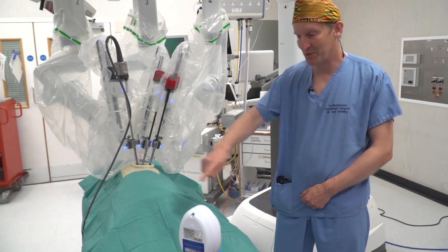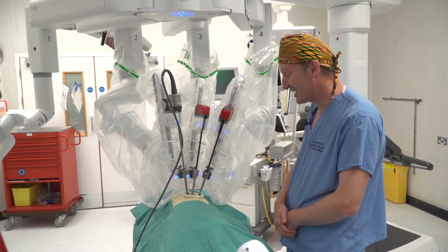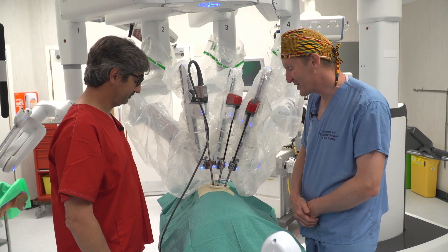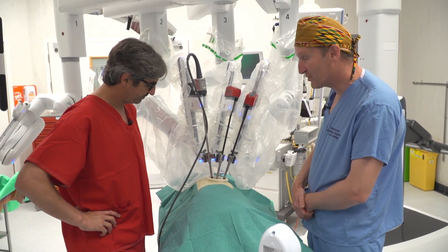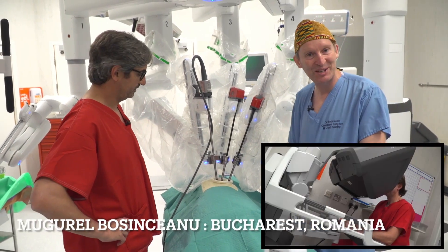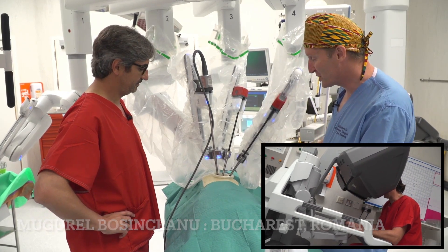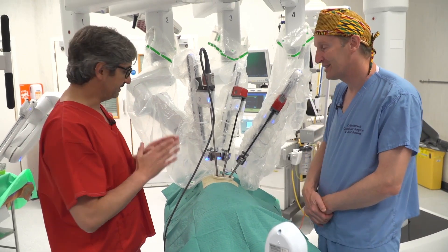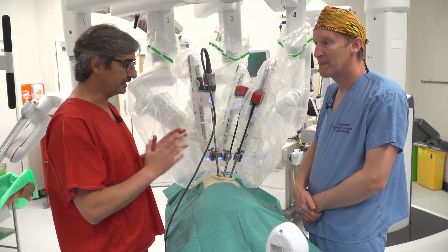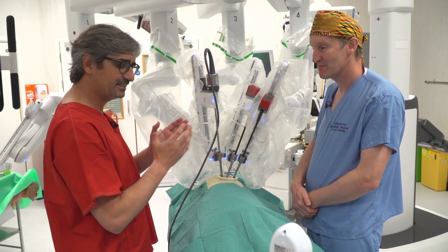Let's go to the robot. Here we have a patient — slightly plastic — who has agreed to have a right upper lobectomy. We're also very lucky to have Mugur on the console from Romania. Talk us through the key points that make this possible. When we use uniportal RATS, the most important thing is knowing how to set up the arms. That is crucial — if you don't do this properly, the surgeon at the console is completely limited and cannot move forward.